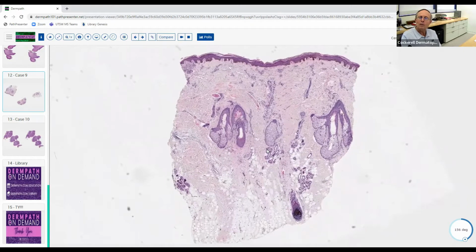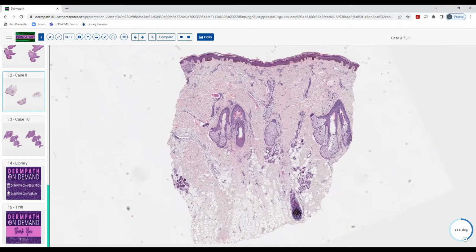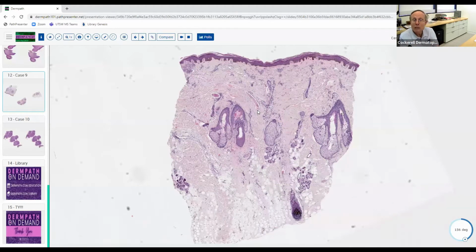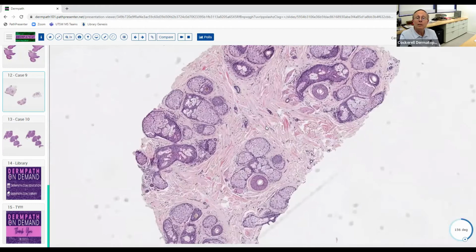Yeah, so if you look at their scalp, what's it going to look like? It's going to look bare. There aren't going to be too many hairs in there, right? They're going to have an alopecia here. So in dealing with alopecias, what's our approach? I guess you're trying to see if they're scarred or it's inflammatory. Yeah, is it inflammatory alopecia or not? If it's inflammatory, is there scarring or not? Permanent or not? If there's scarring, is it more diffuse? Is it more localized just where the individual follicles are? Those kinds of things. Let's look over here, see if we see anything.